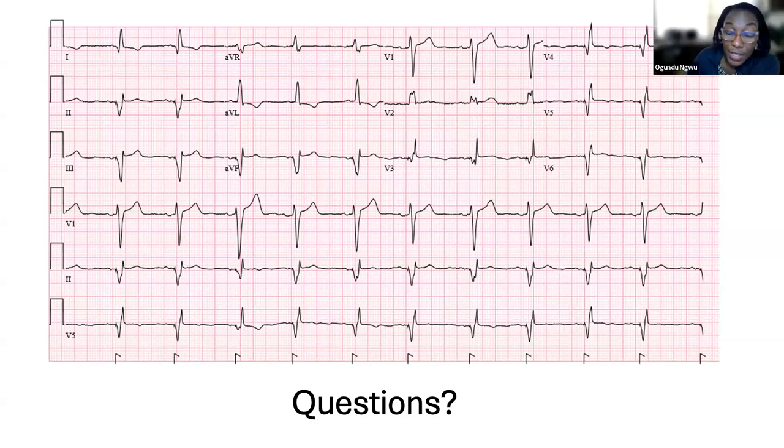Yes, for this particular patient, because it's an ICD. So when I did him, I couldn't get an LV lead in. So I actually put in a device and I capped the LV port, just to not be wasteful, with a view to come back in a few months. Maybe the valve will be more cooperative that day.